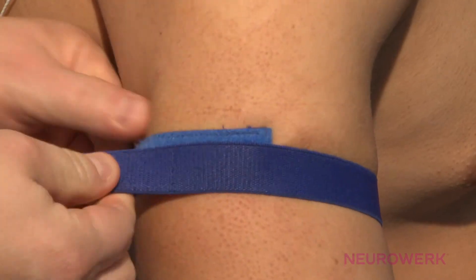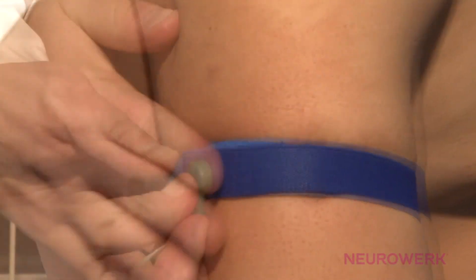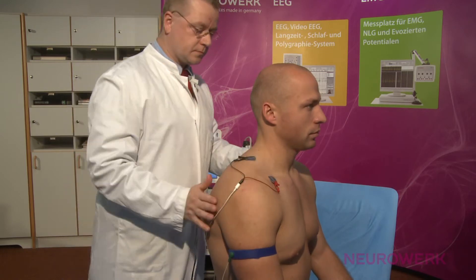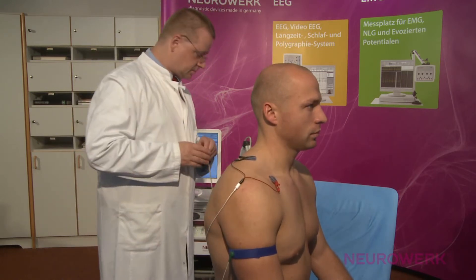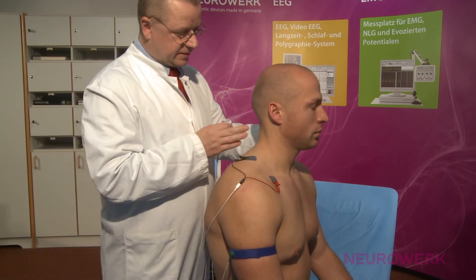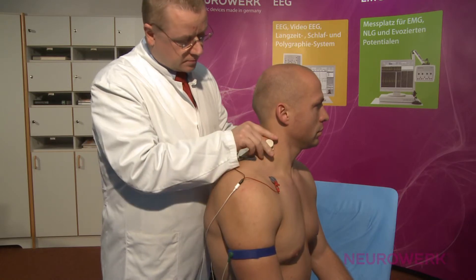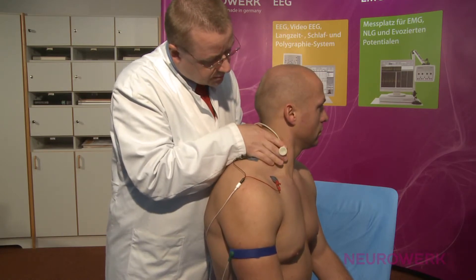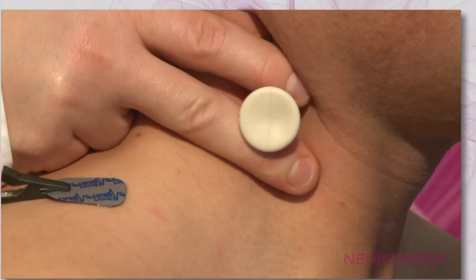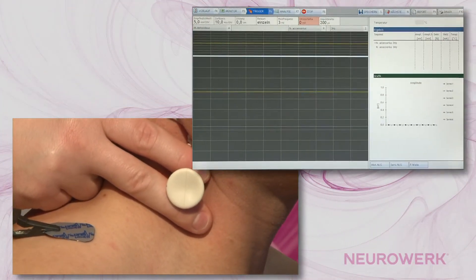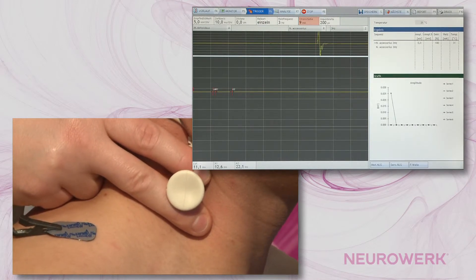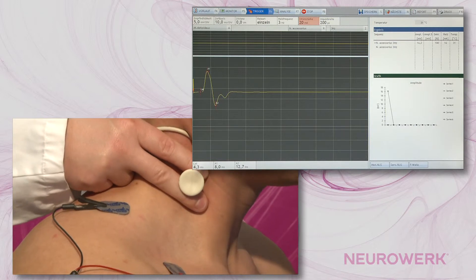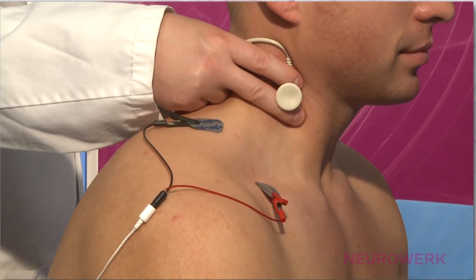The grounding strap should be moist and must be attached to the upper arm. The accessory nerve is stimulated laterally in the neck behind the sternocleidomastoid muscle. The exact stimulation position can be determined by turning the patient's head to the opposite side. The stimulus intensity increases slowly until the amplitude of the potential does not rise any further, and is then increased by another 20% to reach the supramaximal stimulus intensity.